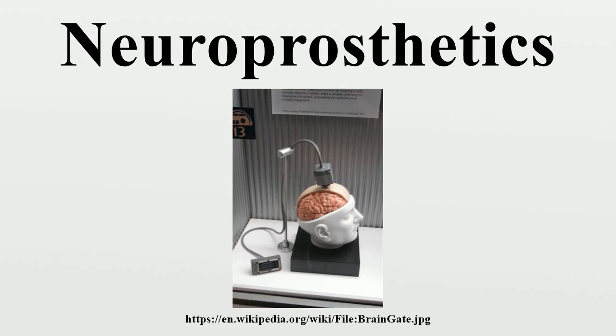Some researchers, such as Kendall Wise at the University of Michigan, have proposed tethering electrodes to be mounted on the exterior surface of the brain to the inner surface of the skull. However, even if successful, tethering would not resolve the problem in devices meant to be inserted deep into the brain, such as in the case of deep brain stimulation.